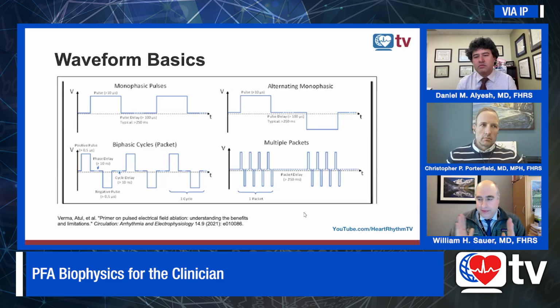And we have all these different variables that as electrophysiologists we have no control over. All we can do is push a button. But we have to trust the animal studies and the clinical studies that the manufacturers used, where what they're trying to do is deliver the most specific destruction to myocytes without causing heating of those electrodes. I think a lot of the companies have proprietary information about their waveform because they've done a lot of work to make it as safe and as effective as possible.